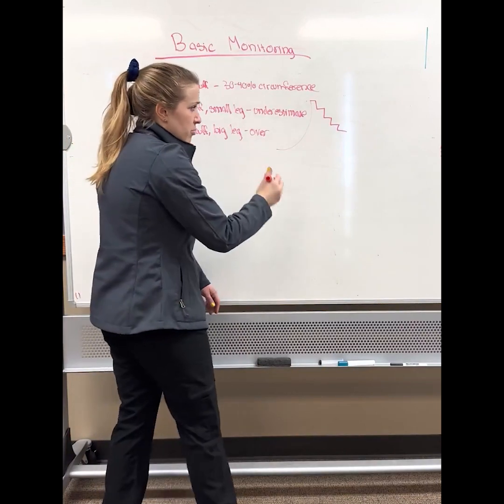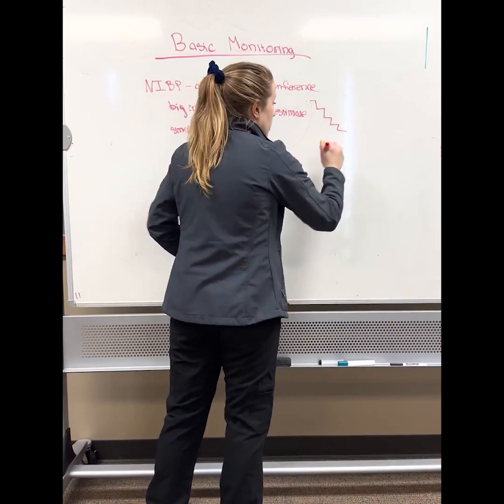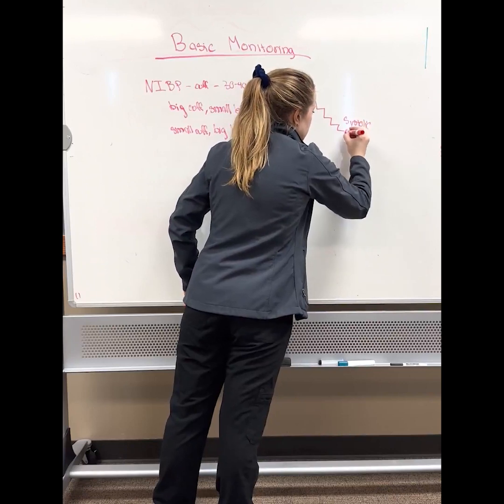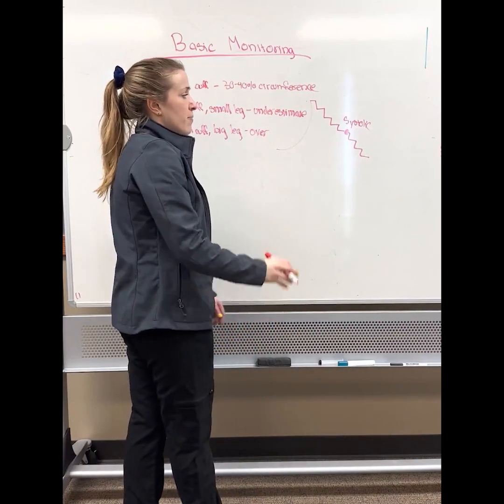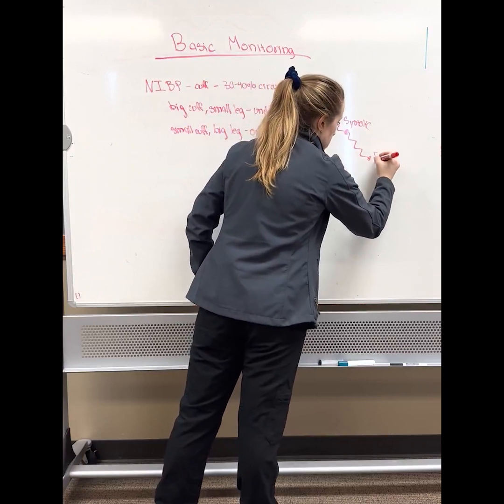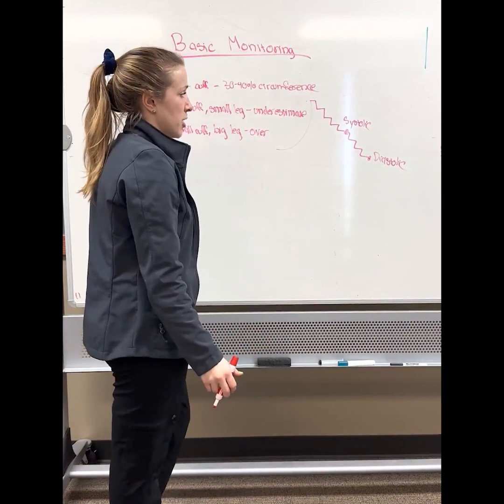And as it lets down pressure, the systolic blood pressure will be read at the point at which blood flow first starts to come past the cuff: systolic. And then the blood pressure cuff is going to keep letting down pressure. The last pressure at which flow scoots past, the reverberations are read there. And this is going to be the diastolic blood pressure. So the diastolic blood pressure is the blood pressure during diastole, or the resting phase after contraction.